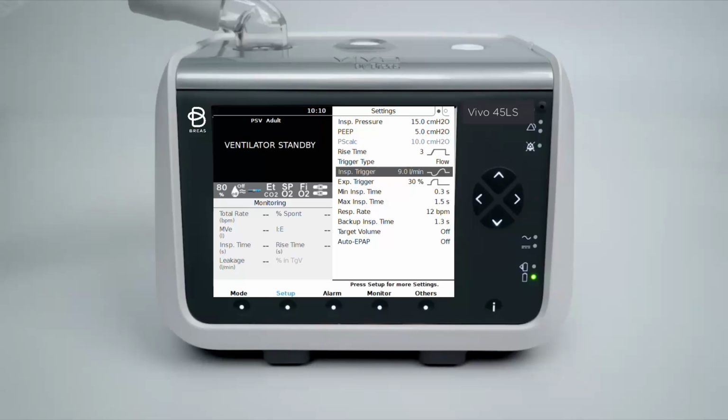In a pressure support mode, the expiratory trigger can be adjusted, which allows you to match the patient's breathing cycle as closely as possible and allow for a smooth expiration. A setting of 90% would mean a 10% drop in peak flow would cycle into the expiratory phase. This can be set down to 10% or a drop of 90% of peak flow.